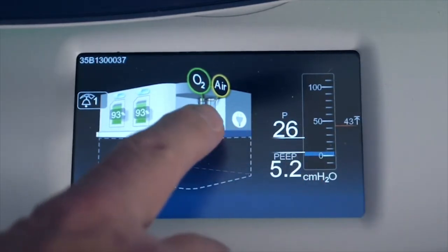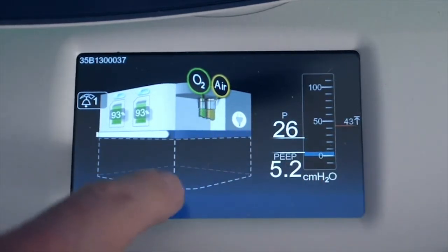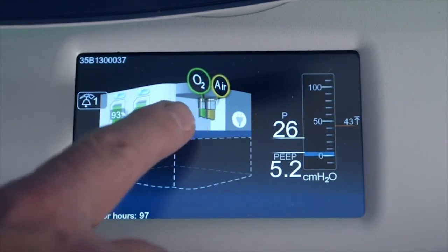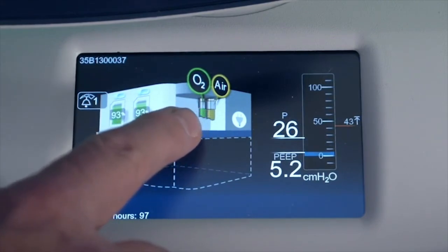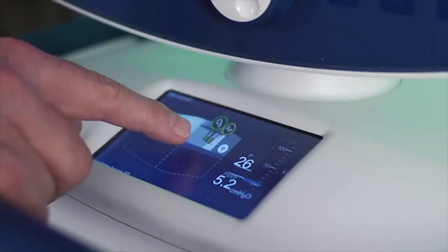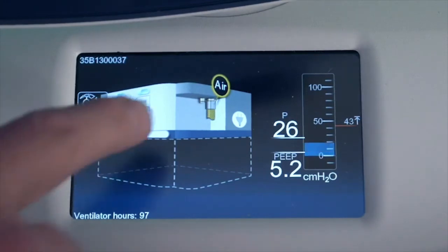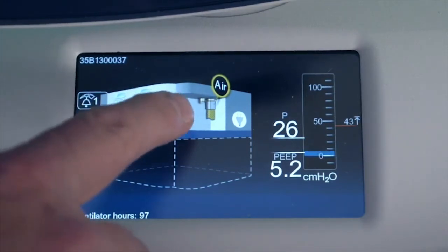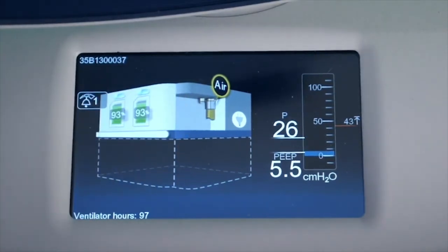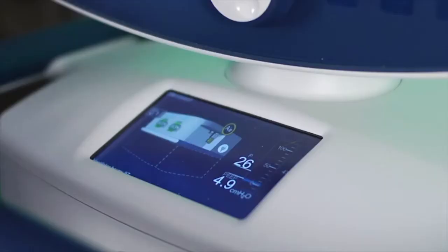Moving a little bit to the left, we can see our gas sources — air and oxygen. If I were to remove one of those, you can see that you lose the whole icon for a gas source. I'll go ahead and plug that back in, and you can see what it looks like once your gas source has been restored.